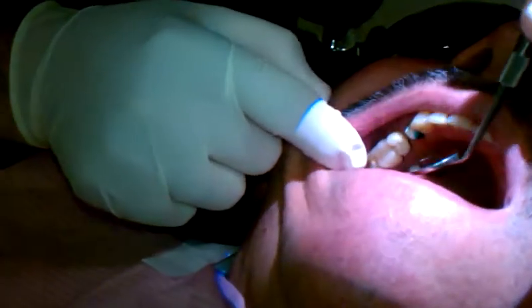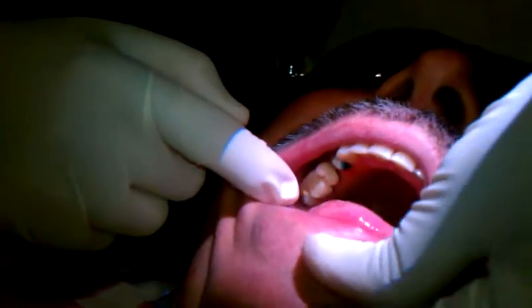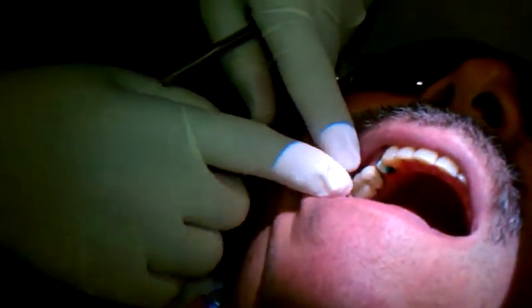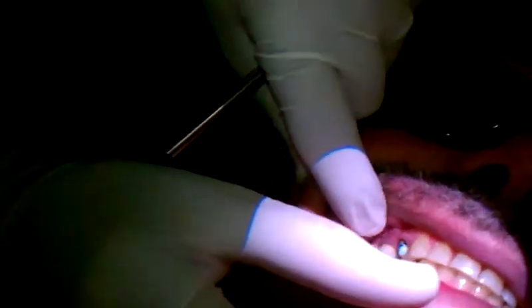Okay, I've made the preparation. I want to make sure that there is enough occlusal reduction. Bite, please. Bite. I want to make sure that there is enough occlusal reduction.